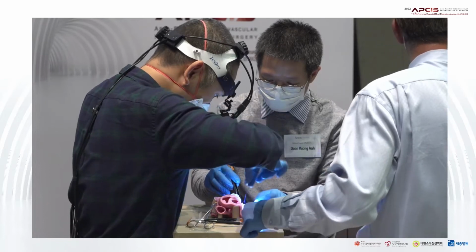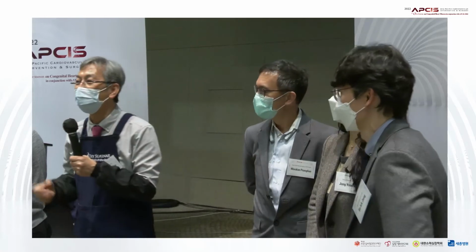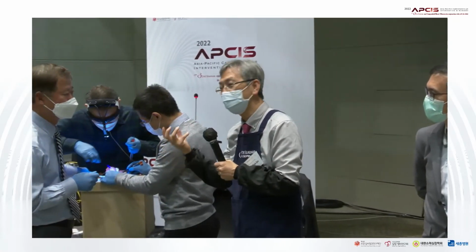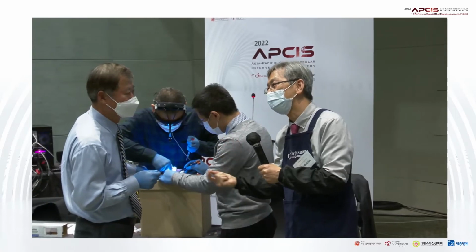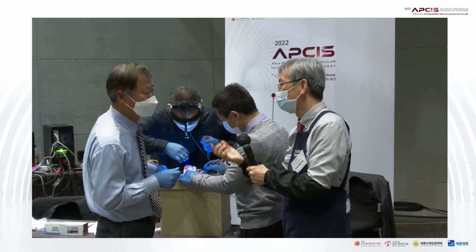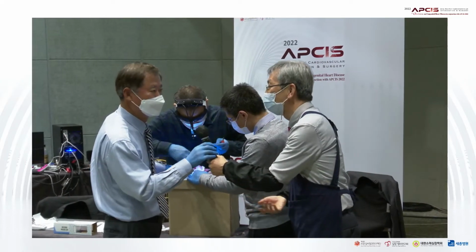Actually, a cc-TGA VSD operation needs a cardiopulmonary bypass time of more than 300 minutes, so they need more time. It's usual for a real patient, and also for this educational simulated surgery, it takes more time, and Professor Gook is teaching the guest surgeon.